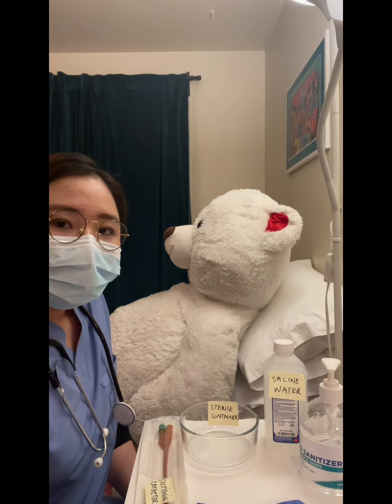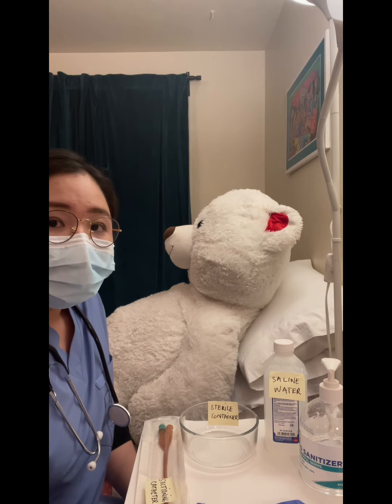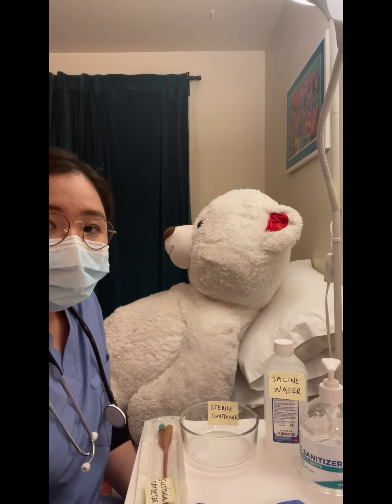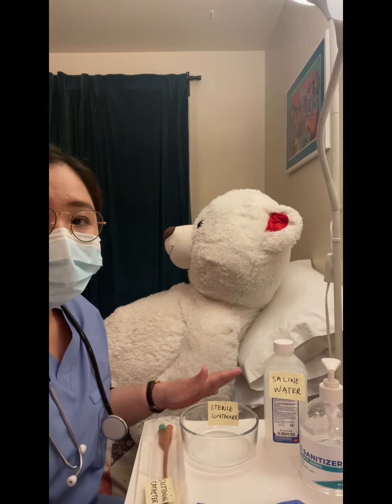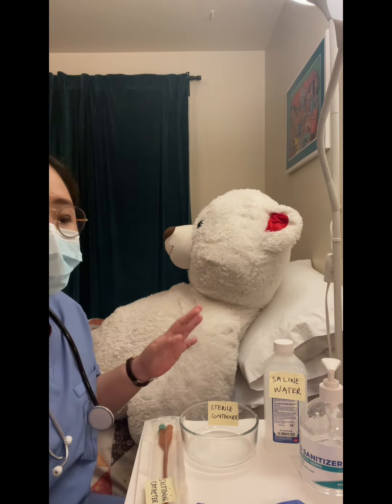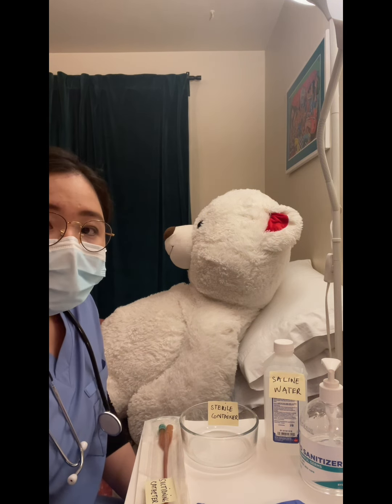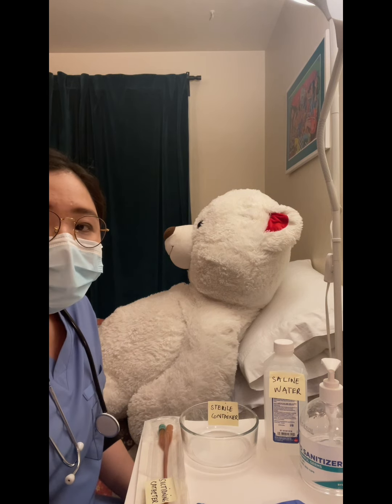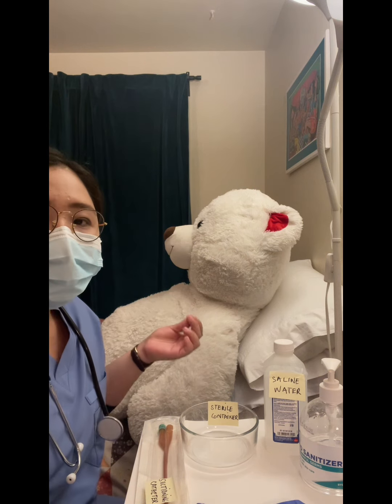Now I will demonstrate the nasopharyngeal suctioning. This method is used to clear secretions from the nasopharynx by applying negative pressure via a suction catheter. So now I'm going to show you how to assemble the suctioning catheter. For this procedure, I will need a suctioning catheter, sterile gloves, and saline water that must be in a sterile container to prime the suctioning catheter before I administer it to the patient.